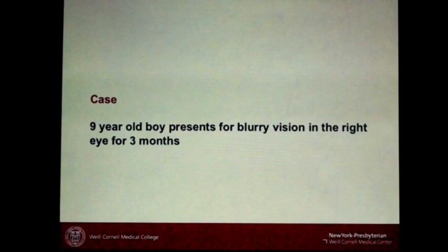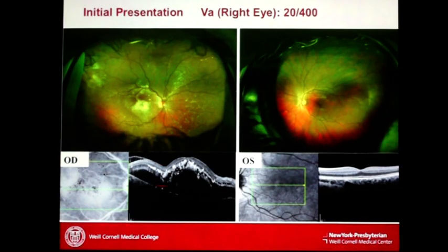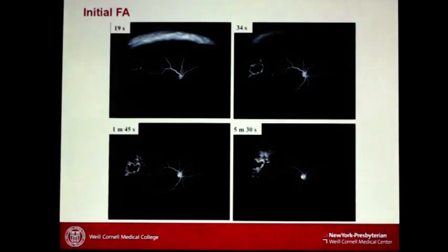Here's another example. This is a little bit of a different case of the same problem, but here we have a lot of macular involvement. Okay, so here's Coats disease. Where's the problem? Do our fluorescein, right? You see that the problem here is in the peripheral retina. Here are telangiectasias, here's the leakage, which is causing that exudation centrally.